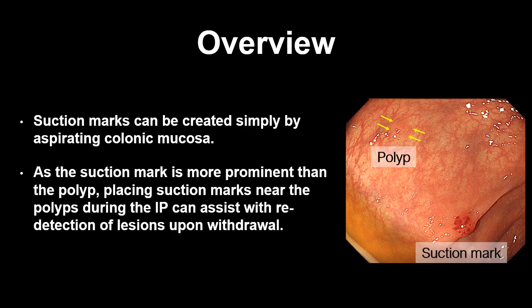Suction marks can be created simply by aspirating colonic mucosa. As you can see in this still image, the suction mark is more prominent than the polyp. Placing suction marks near the polyps during the insertion phase can assist with re-detection of the lesions upon withdrawal.